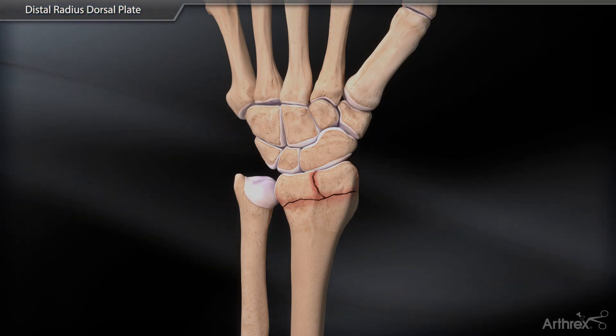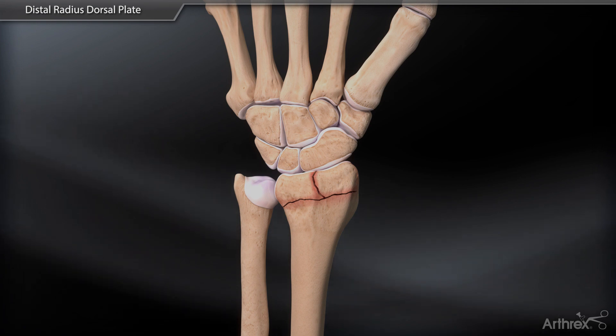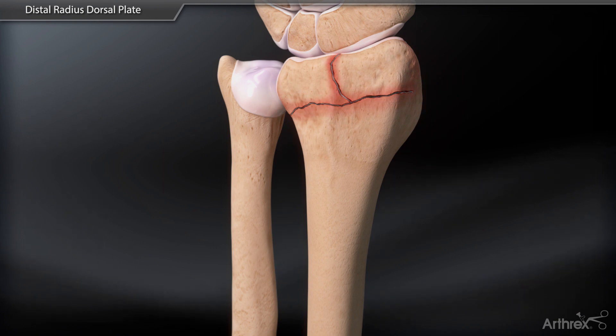A dorsal approach is used over the center of the radius. Lister's tubercle is removed and the joint capsule can be reflected off the dorsal lip for joint exposure and fracture reduction if desired.